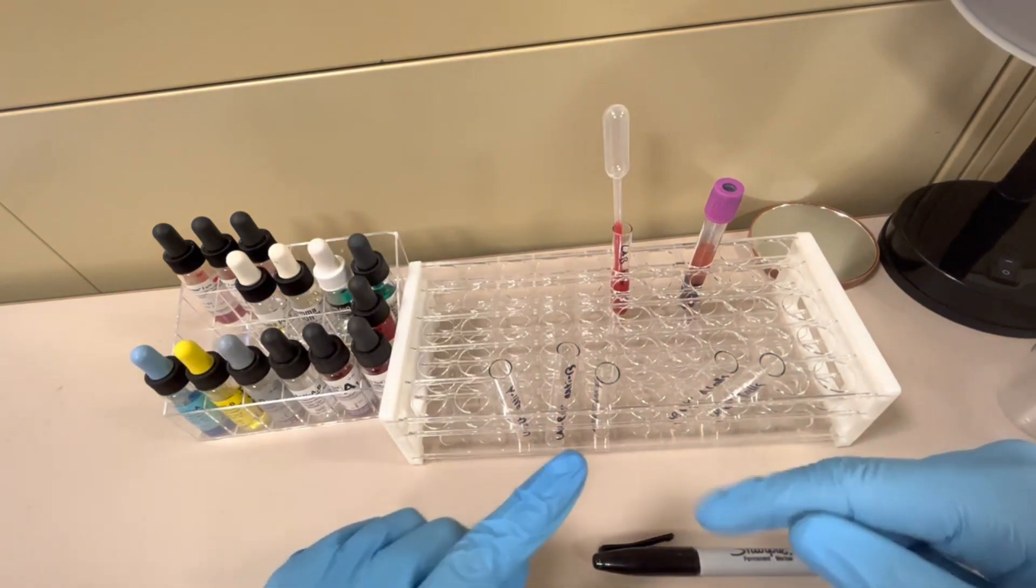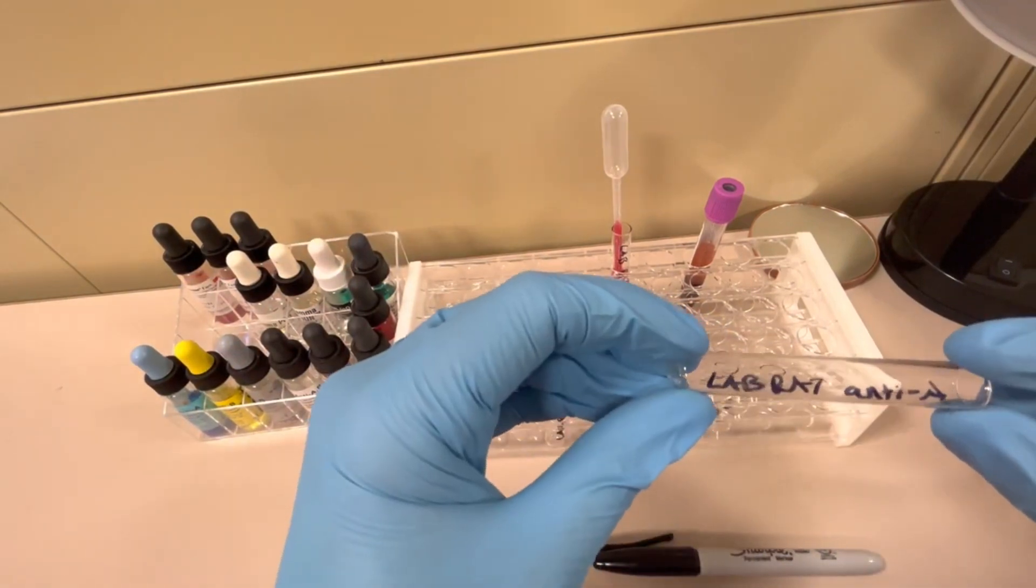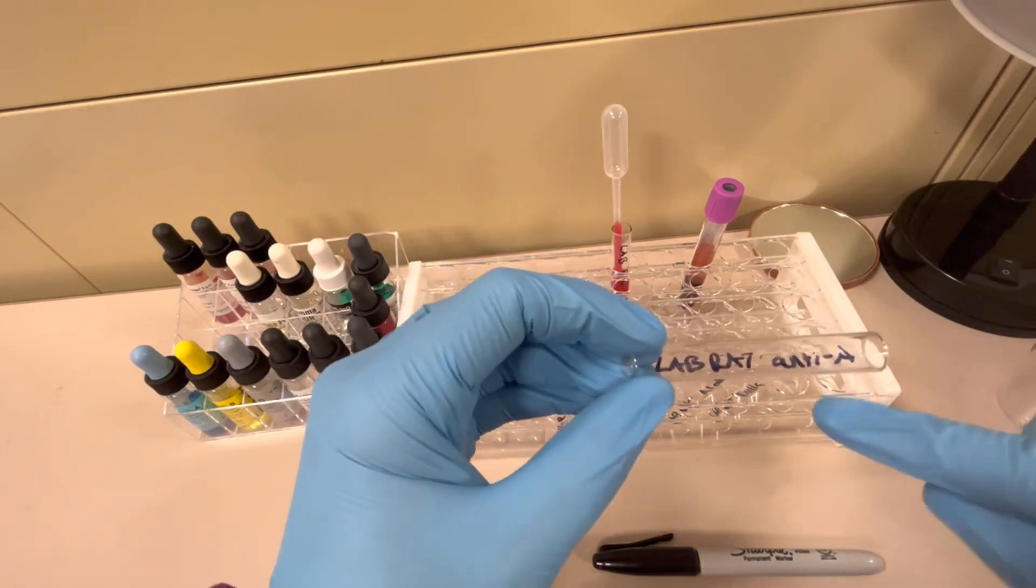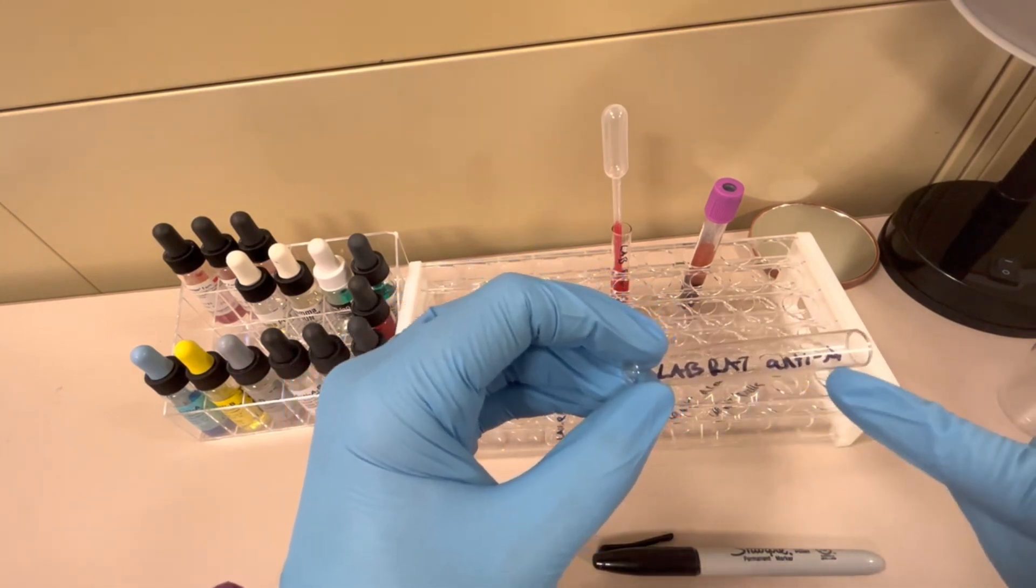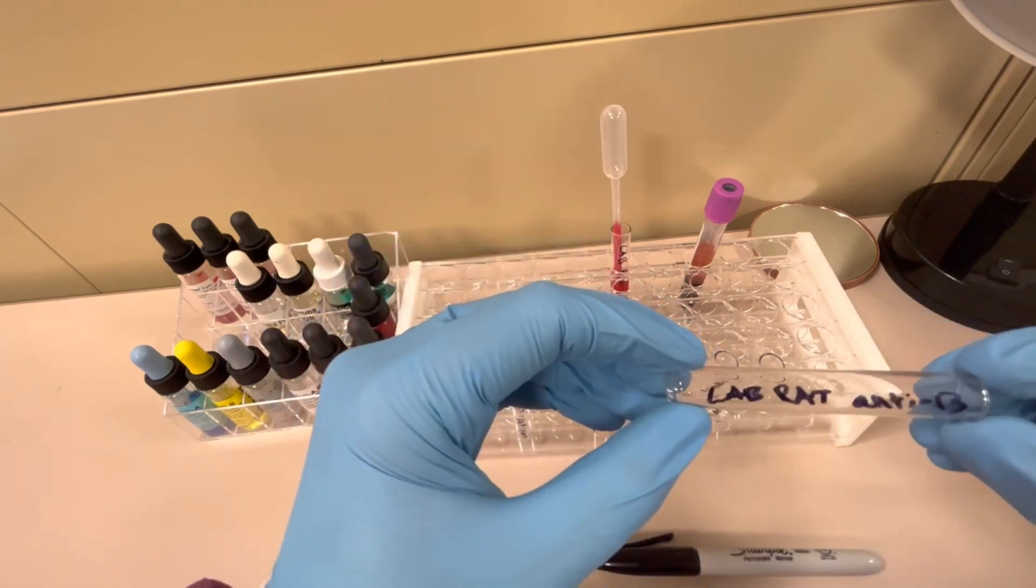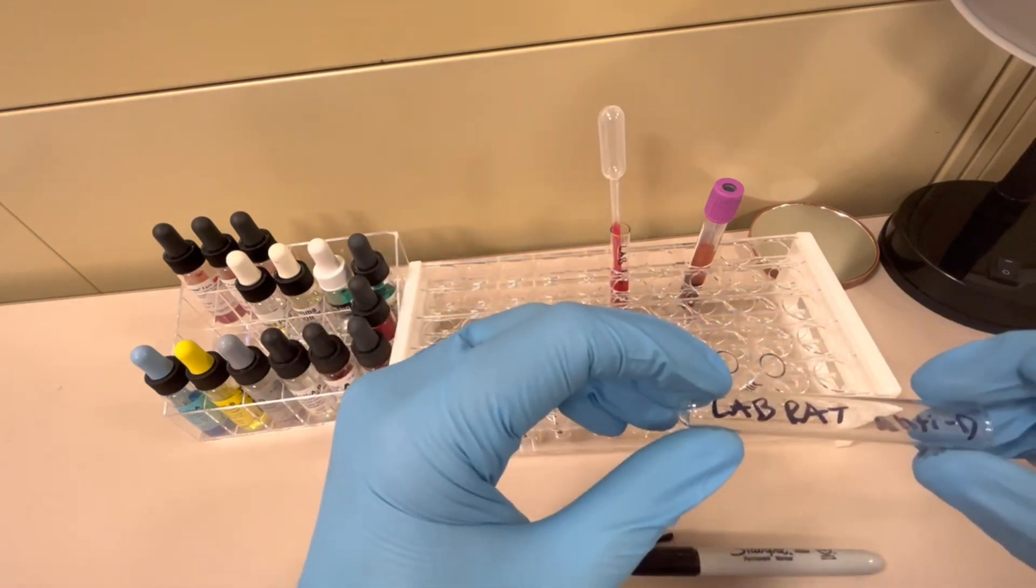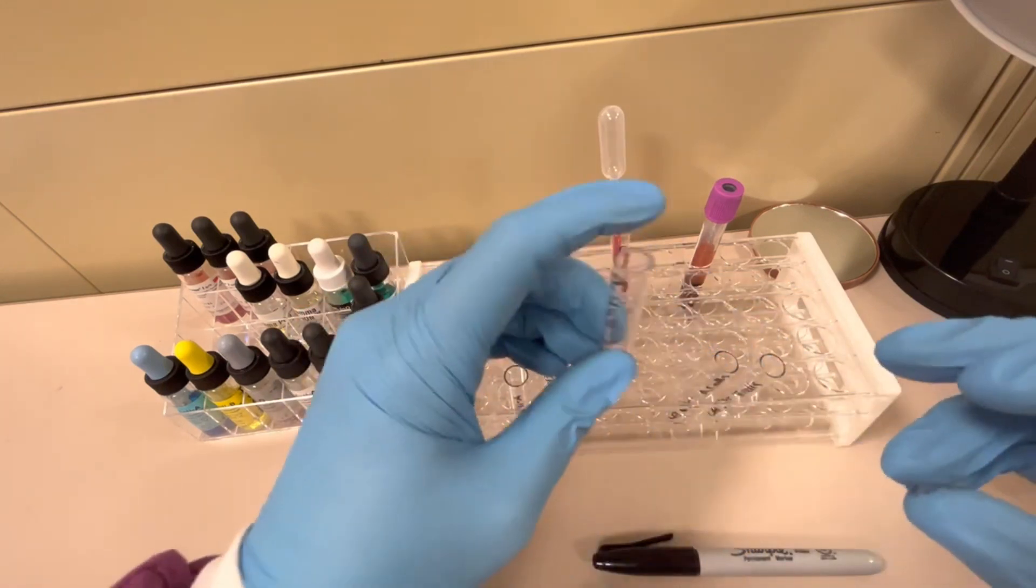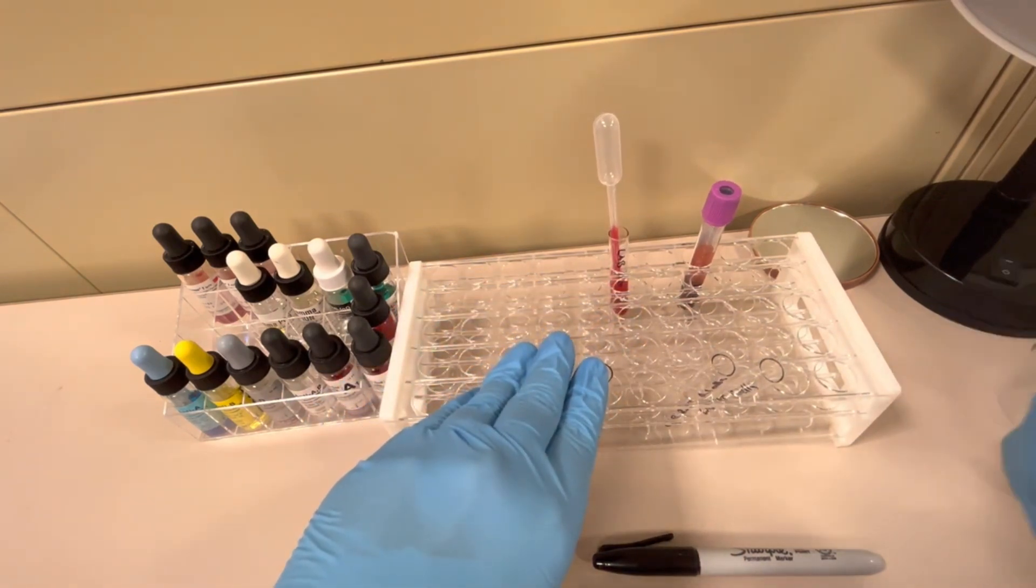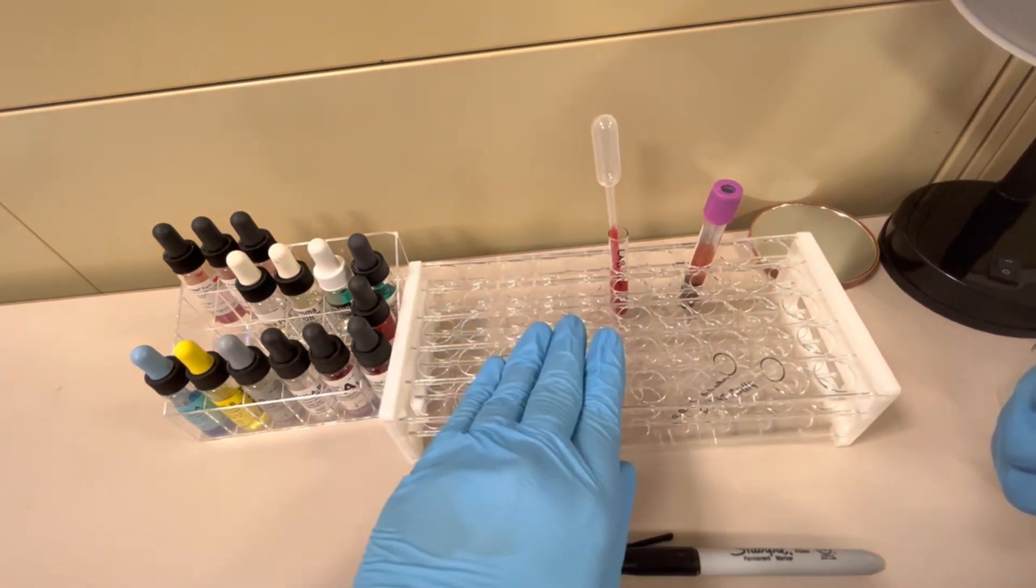I also need labeled tubes. Each one of these tubes in permanent marker I've labeled with the patient's identification and also what reagent I'm going to be putting in here. This one is labeled LabRat and Anti-A. This one is labeled LabRat and Anti-B. The next one is LabRat and Anti-D. These are all my forward typing or my front typing part of the ABO type.